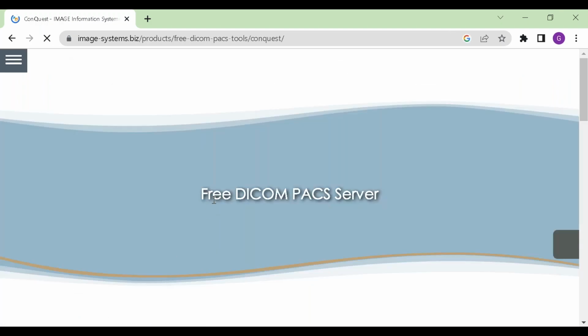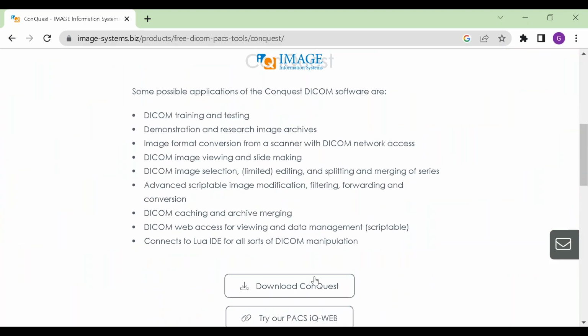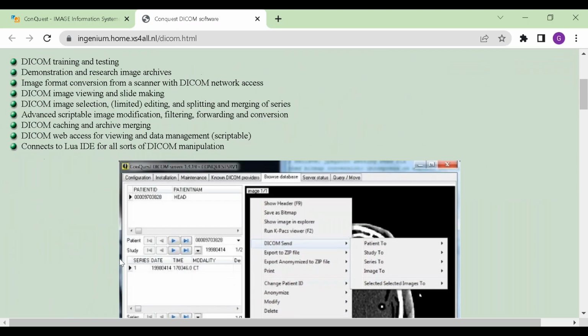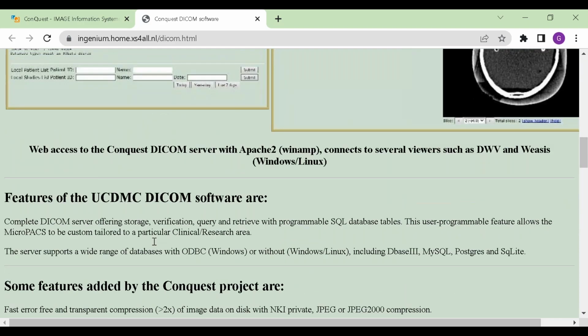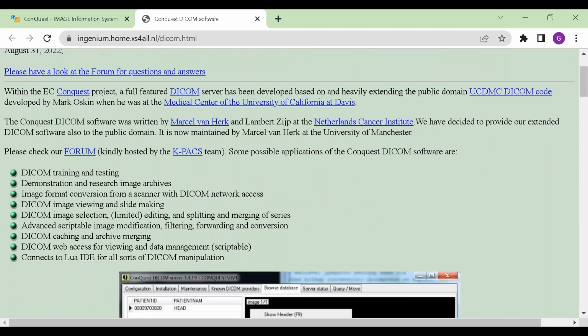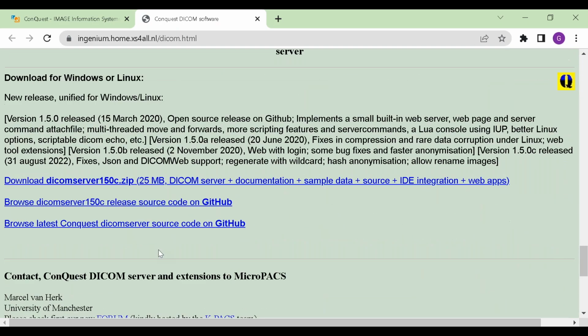This will take you to the people that are hosting the front end of this. You scroll all the way down, it tells you what it can do. You go to the download and it takes you to the same page anyway, right? So up top here is a whole bunch of provisos of how it was created, some demo stuff, and this is basically how you put together a web page in, pardon my saying it, 1998. But you scroll all the way down here, and there's the most current file.